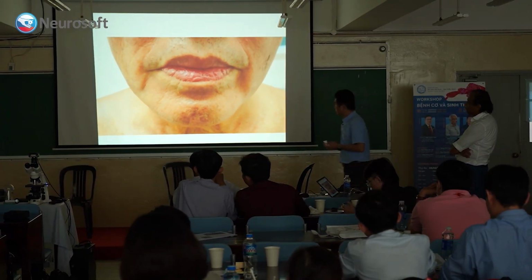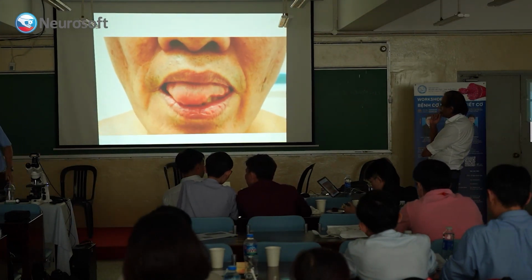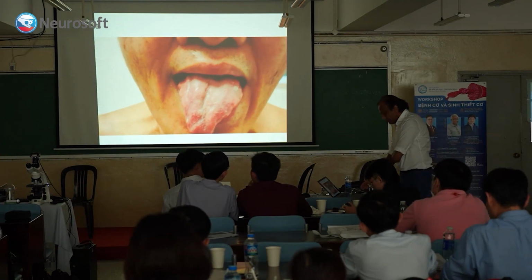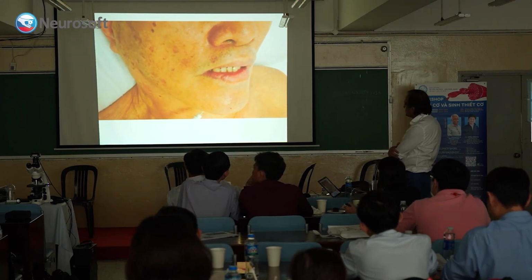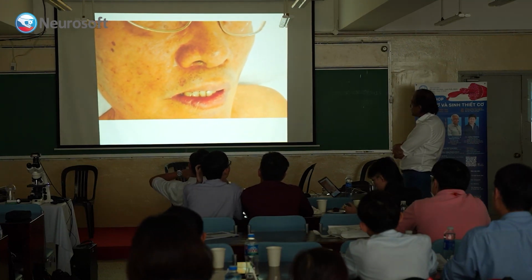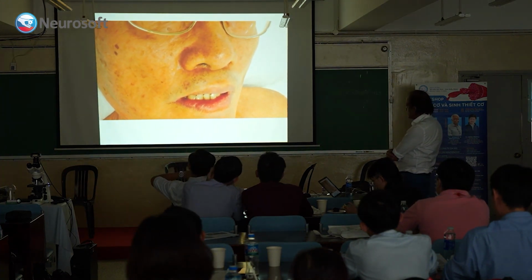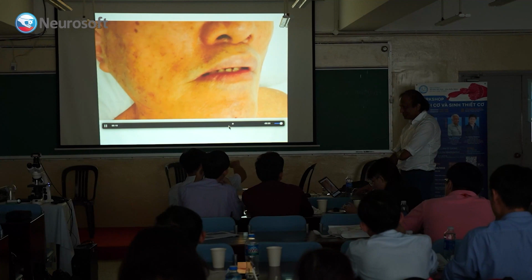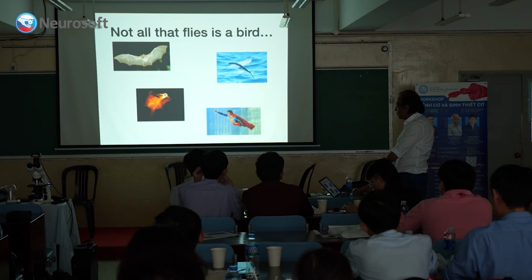See, when I do that, then it becomes very obvious. So when you do EMG also, we do that. We put the needle in, then you look at the tongue. And then this is what we do. We put the needle in, and then we ask them to do that. So there are some fasciculations on the face. But movement disorder, the doctor is saying it might be fasciculation. Yeah. No, but if it's diffuse like that, I will call it fasciculations.